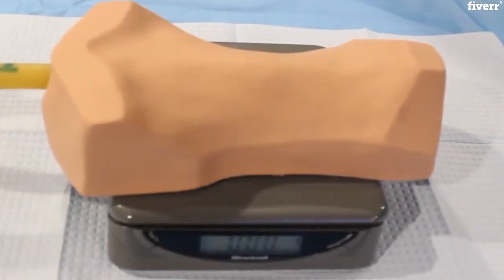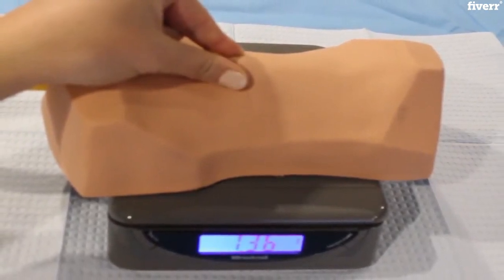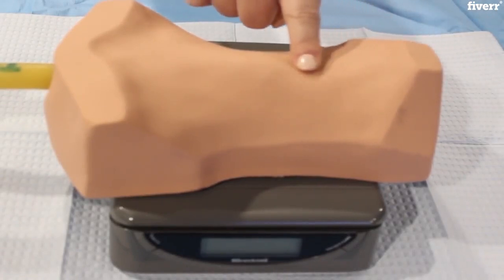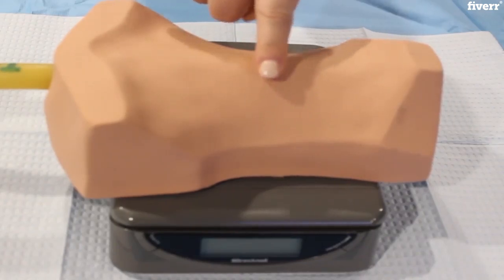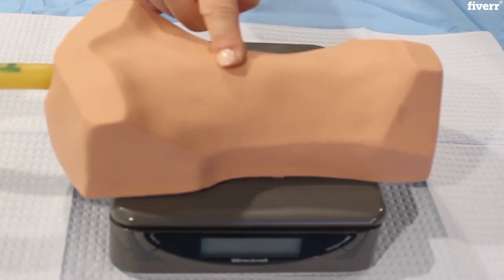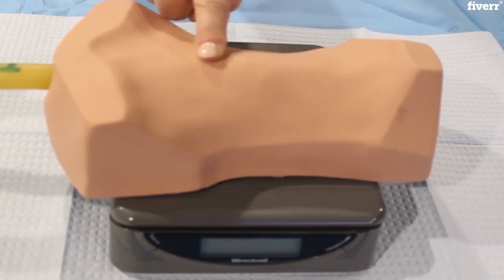We're now going to switch to our cricoid pressure video to demonstrate correct technique and force on our simulation model. Begin at the chin and slowly palpate until the laryngeal prominence is located. This is the thyroid cartilage. Once located, continue to palpate caudad until the cricothyroid membrane is identified. The cricothyroid membrane will feel like a small divot between the thyroid cartilage and the cricoid cartilage.